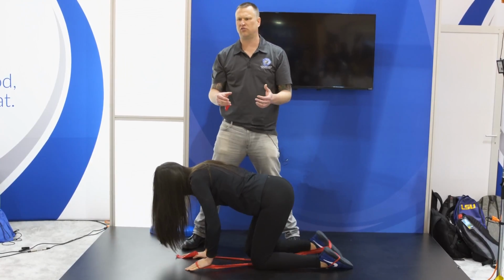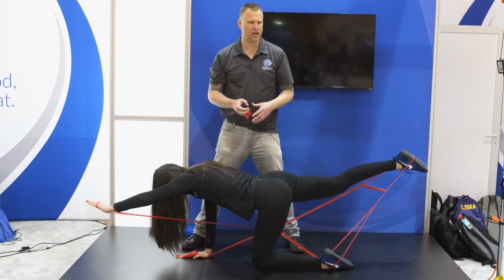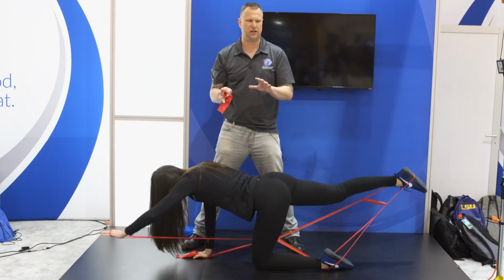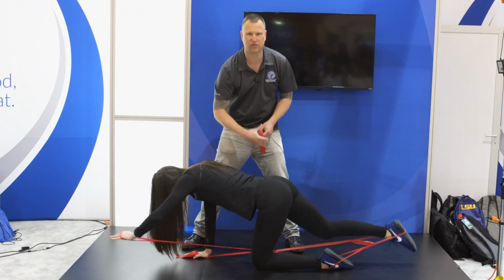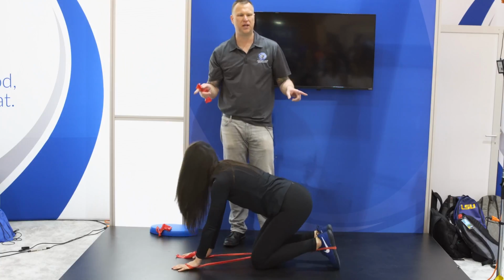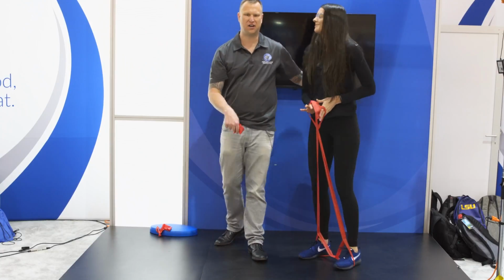And a lot of times in those situations, that creates needless shear, rotational shear components in that lumbar spine. So I, a lot of times, just so you hear that again, try to avoid that left, right, and really say, let's do 2 sets of 10 on one side, let's do 2 sets of 10 on the other side, and really focus on that stability. An advantage of the CLX, we can start looping it around multiple areas of the body, okay? All right, let's go ahead and stand up here. I appreciate this, not easy getting on a hard surface here.